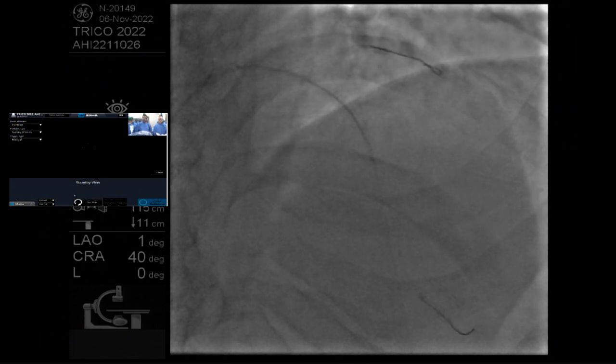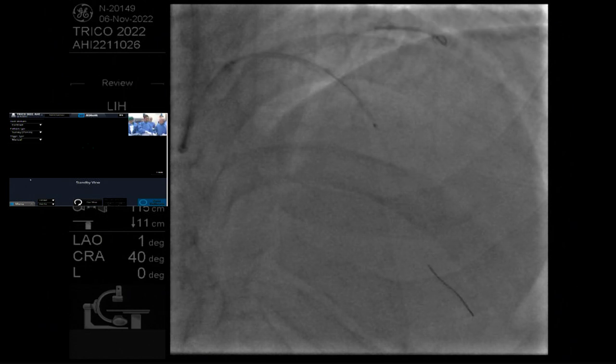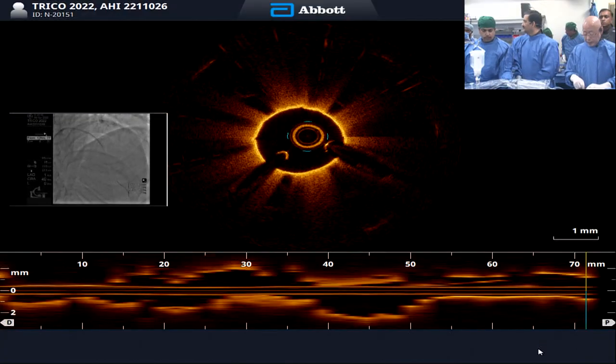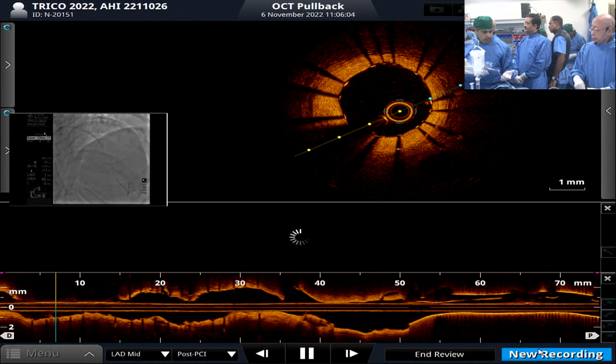So this is actually a very good discussion. Elvin, do you bring people back in CTO PCI where you've stented them and their vessels have got large segments of intramural hematoma that you've stented over? Not so much for CTOs, and actually it's a good point, I never thought about this, but mostly for people where we have dissections that are visible with the eye, as in this situation, or spontaneous dissections, I regularly bring them back. And I don't put the stent in at very high atmospheres, especially not to squeeze the hematoma to propagate between the intima.